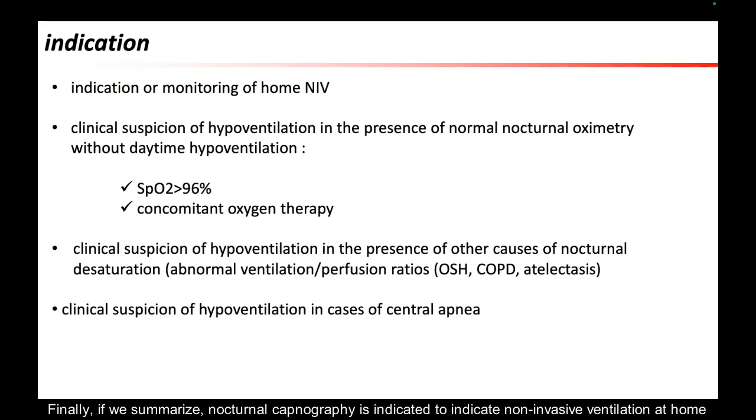Finally, if we summarize, nocturnal capnography is indicated to initiate non-invasive ventilation at home, or to monitor this non-invasive ventilation in the face of the clinical suspicion of nocturnal alveolar hypoventilation when nocturnal oximetry is not interpretable due to a peripheral capillary oxygen saturation greater than 96%.